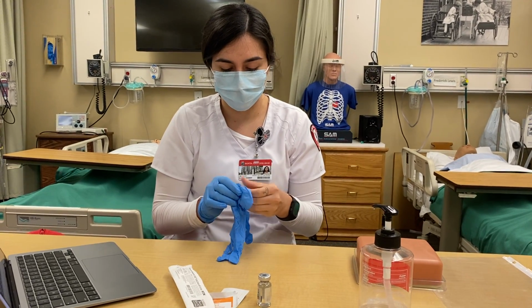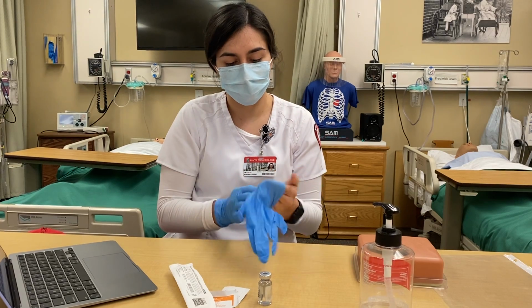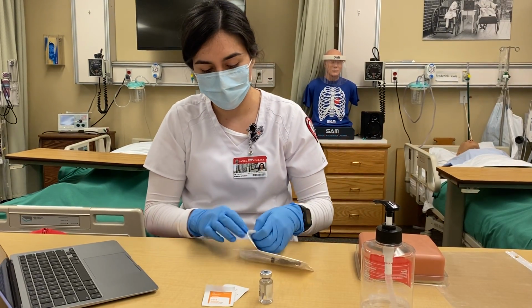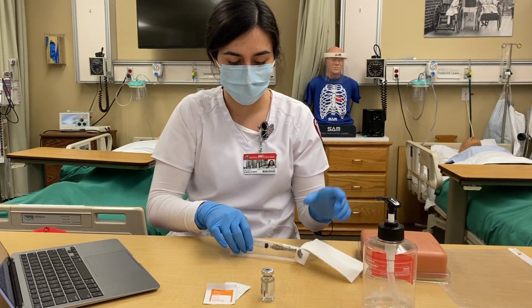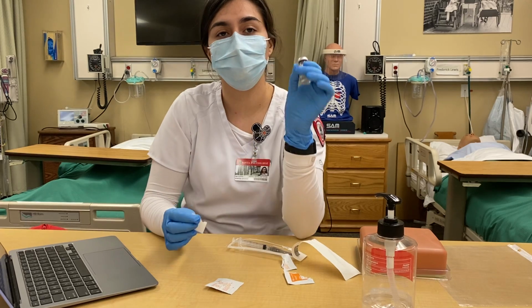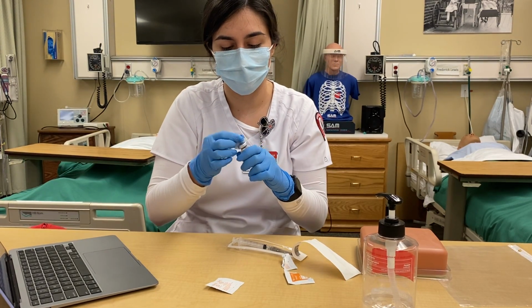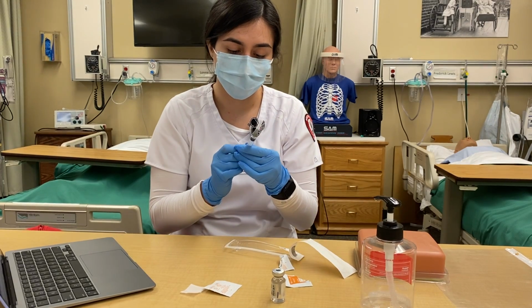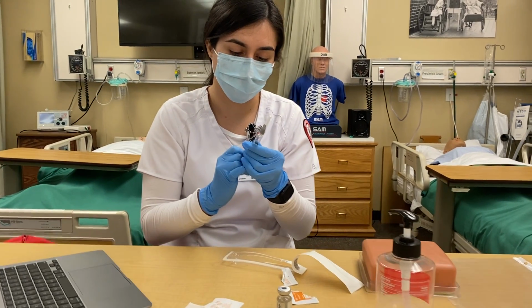Okay. I'm going to get my medication ready. Open this up. Clean this up. I'm going to pretend this is my vial. Okay. I'm going to get 2 mLs.